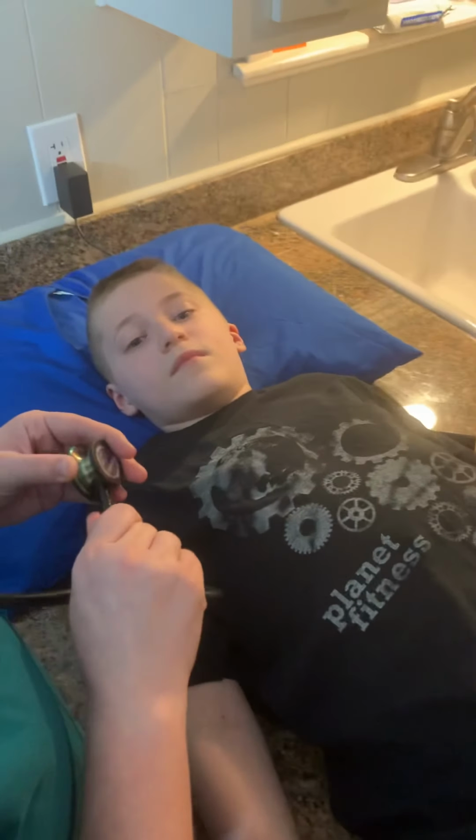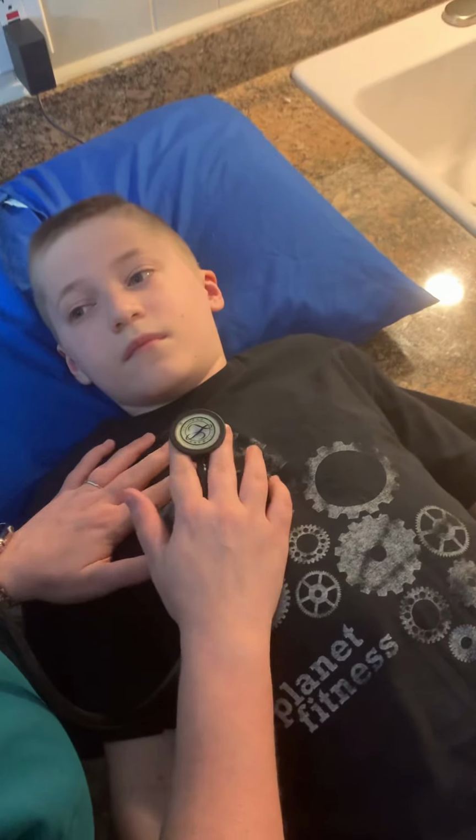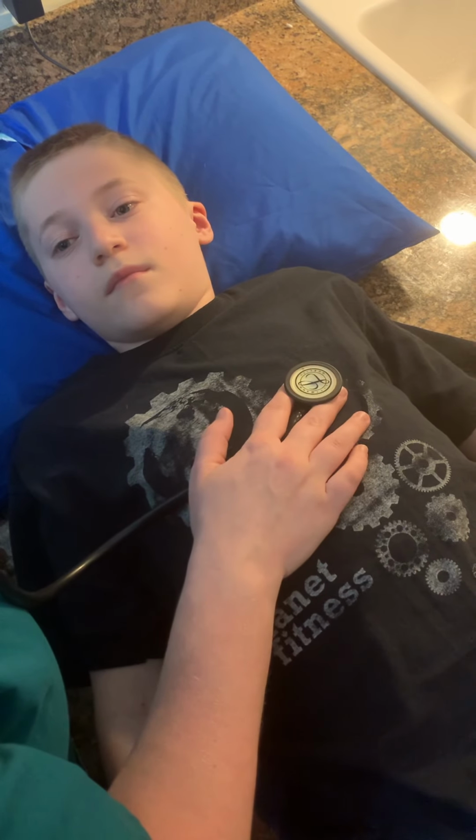Okay, flipping over to the bell of the stethoscope. We're going to listen to all those same spots again. I have your aortic, your pulmonic, Erb's point, tricuspid, and your mitral.